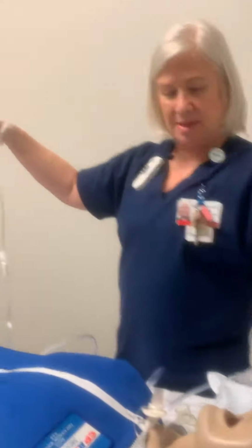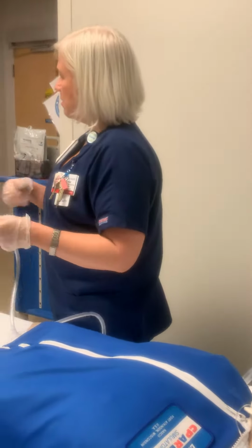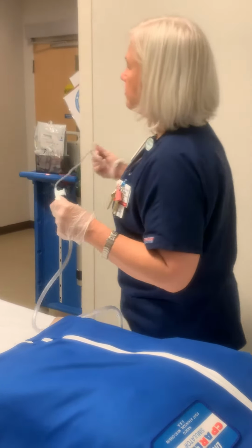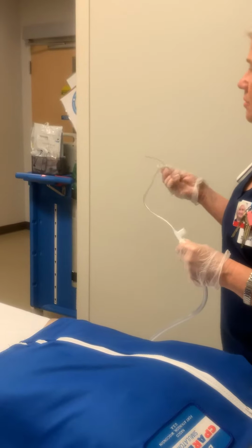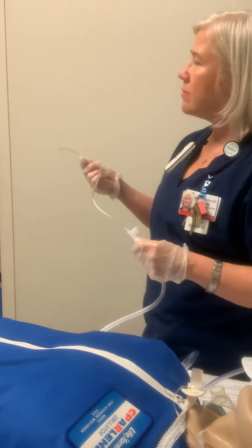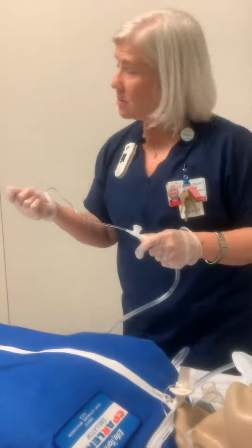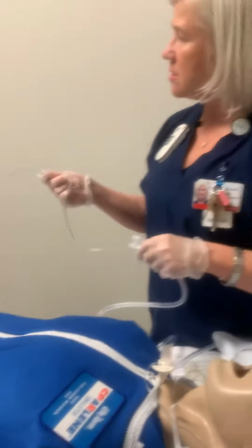Okay. Just so you know, here we don't do that. That's what I was going to ask. You guys aren't ambuing here whatsoever. You just suction them out. Or do you monitor their sats? These people are pretty well established trachs. They're caring for these at home and they're good. Sometimes it's the position when we get the mask and we lay them down that they get a secretion built up. And so we just come in and suction it. Usually it only takes 1 or 2 times and they're good to go. But we don't ambu before or after, no. Well, then that's whatever your policy or whatever y'all do over here, then do that.